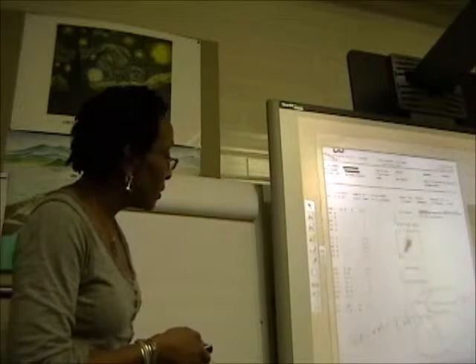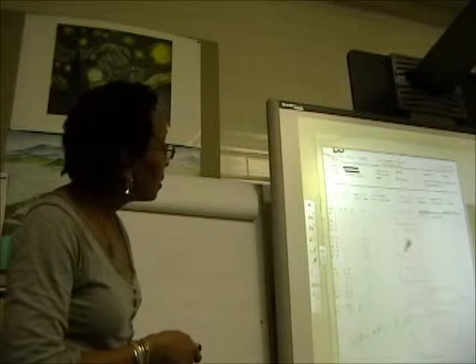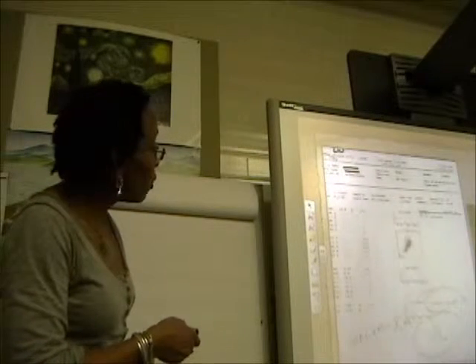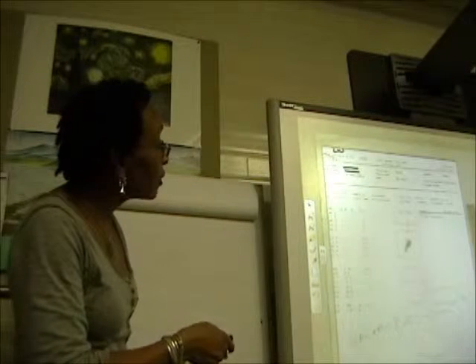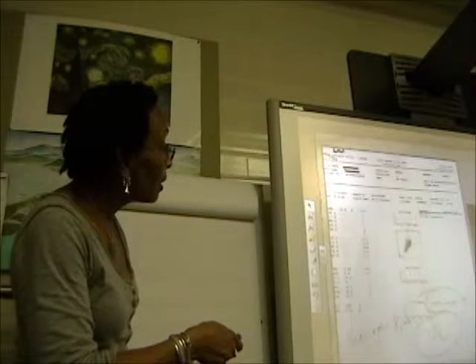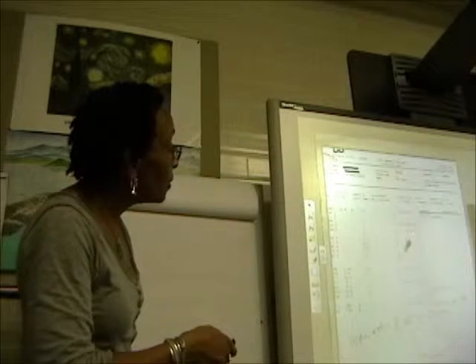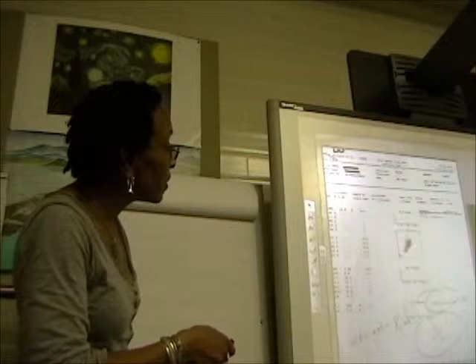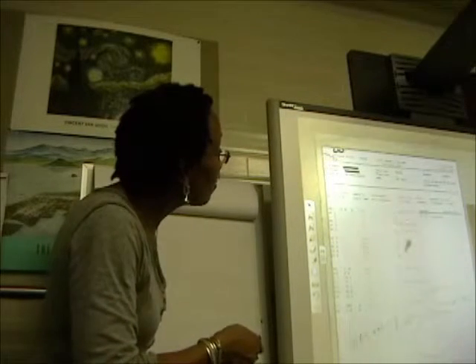And this one right here, they had to do a WBC estimate, because you've got your R flag on the WBC count. They've got cellular interference, okay? And then they've got the flag for immature cells. And there's no separation of the cells on the data plot. It kind of looks the same right here.